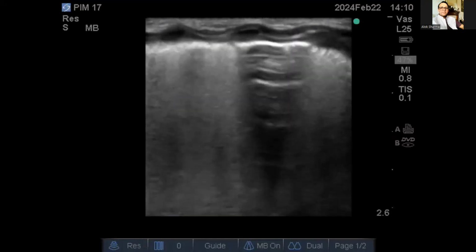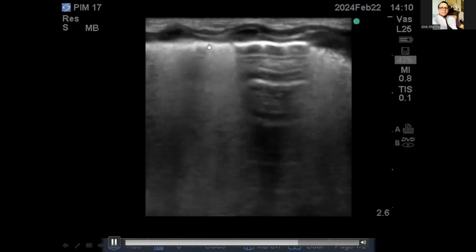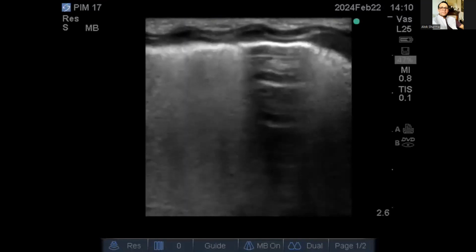And if you can see subpleural consolidations and a clinical picture that fits with an unsteroided boy who's on CPAP and 45% oxygen, then really for me, I feel that there are subpleural consolidations. To get them a little bit better, the Sonosite has sharp mode, so you can go to sharp mode and that'll demonstrate them better.